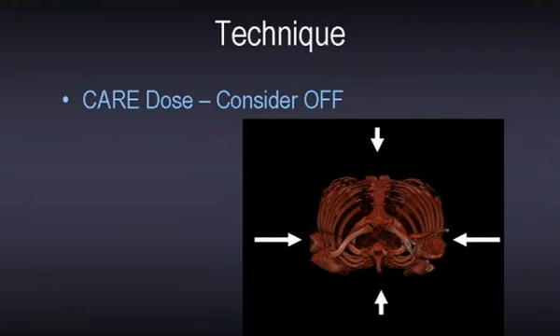What about dose reduction modules? Well, on the Siemens scanners, for example, there's a product called CareDose. There are equivalent features on other scanners. These try to reduce the dose when scanning in the anteroposterior plane and increase the dose when scanning through the shoulders to increase penetration of the patient. However, when the tube is operating at the limits of its ability, as it is in most CT angiogram studies, this artificial reduction in the AP projection can materially degrade image quality. And we have found that the trade-off of a slightly higher dose is very beneficial in improving our image quality on CT studies.